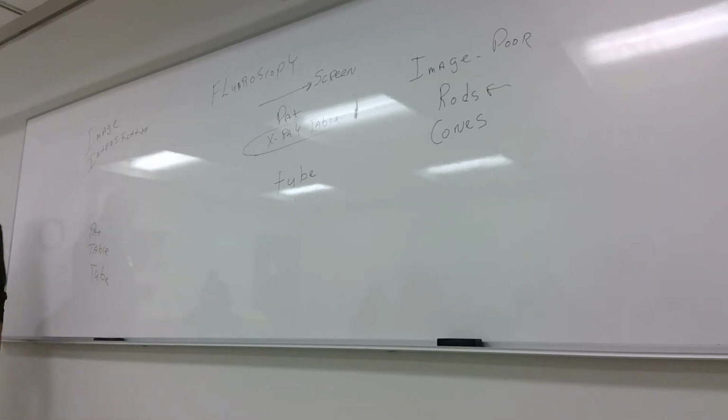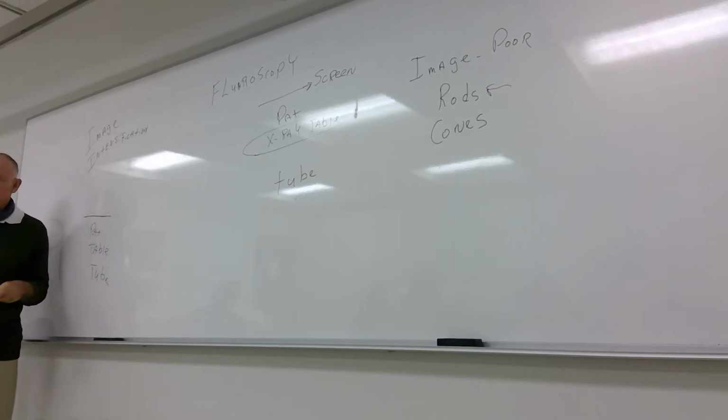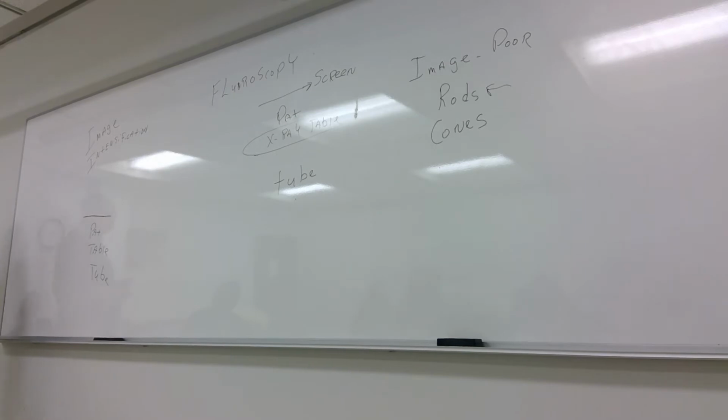Same scenario: tube, penetrate the patient. And then we had a device here called an image intensifier.